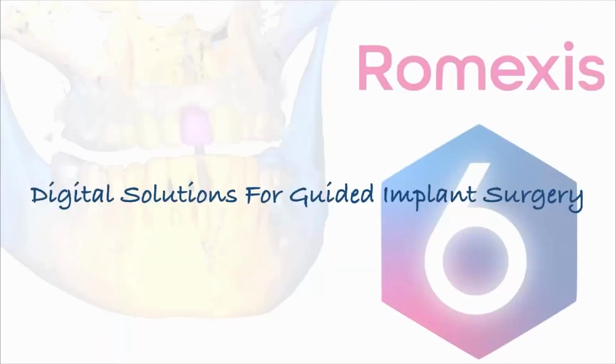Let's talk a little bit today about digital solutions for guided implant surgery. I'm going to create two themes. One is I'd love to walk through what we're using as a typical guided implant workflow and solution, a formula, if you will, that we've created that seems to be working really well for myself, mainly in private practice, but also from the perspective of teaching our residents and our students.